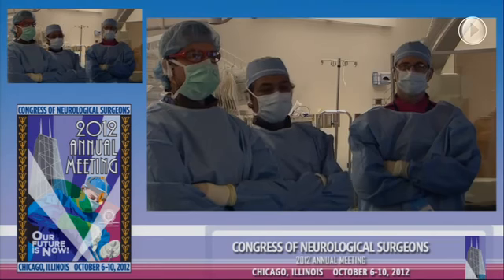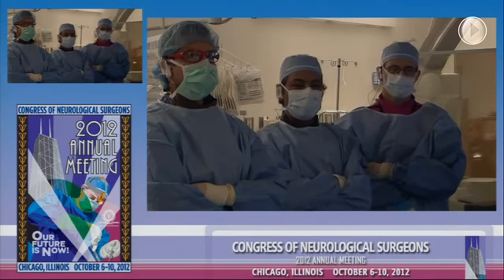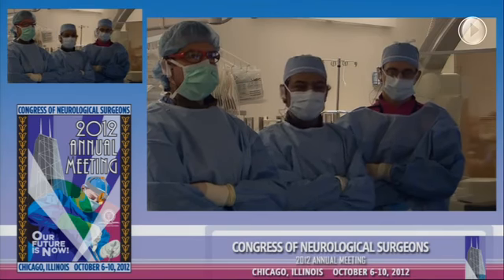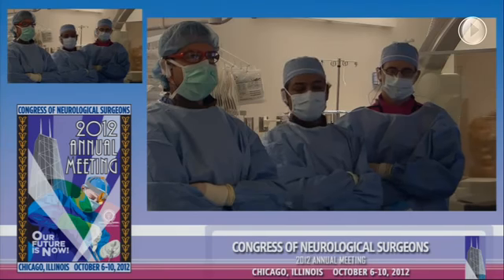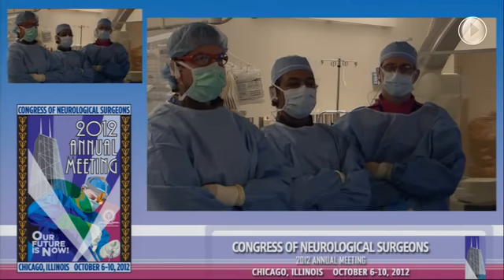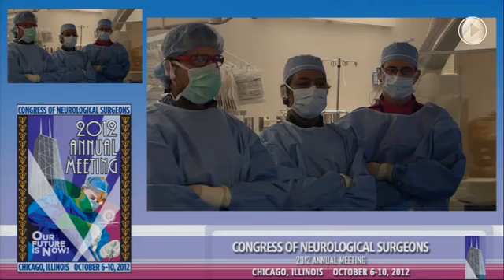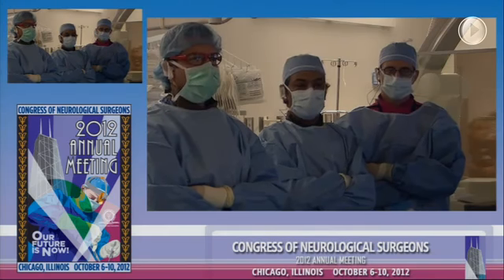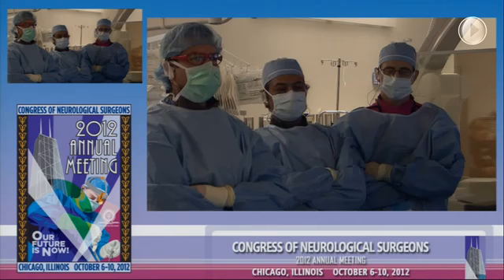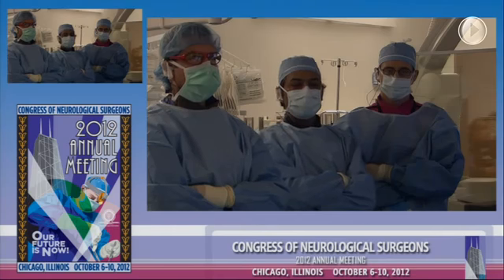So I think flow diversion really for the proximal carotids, and that's a point that needs to be reiterated, the data supports excellent use within the proximal carotid. That's the on-label use. That's the kinds of cases you can do with this, including the ones that we showed today. But when we have ventured beyond the confines of the on-label, really the morbidity and mortality of the procedure becomes much more unclear. Certainly, we have published on our experience on vertebrobasilar giant aneurysms, particularly the fusiform variety, and there seems to be no real good solution there, at least as of present.